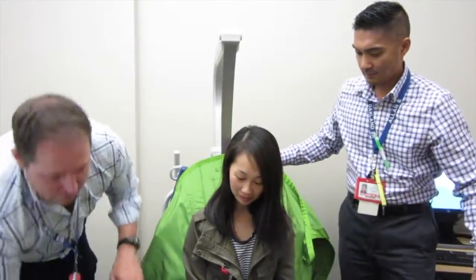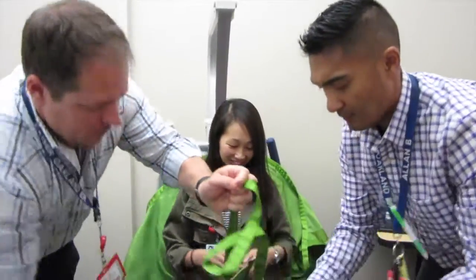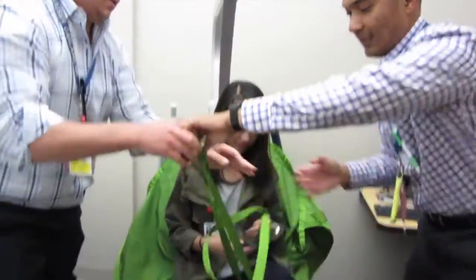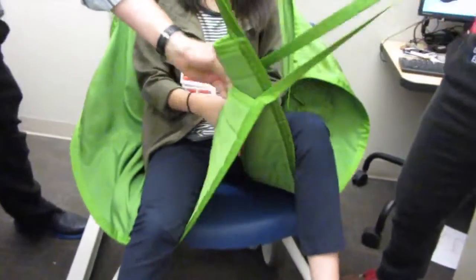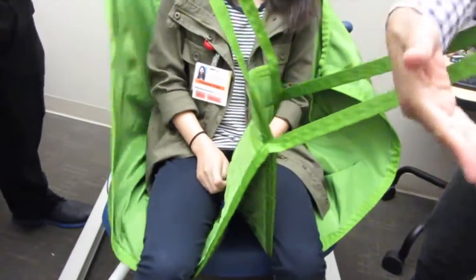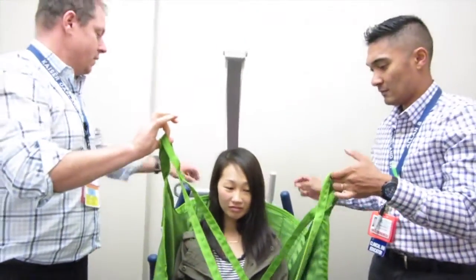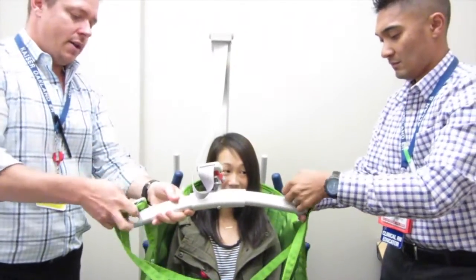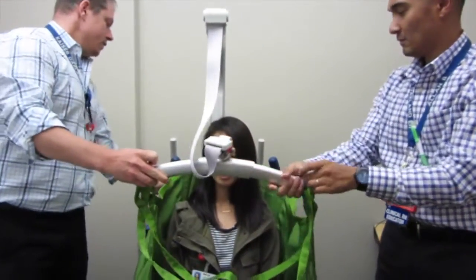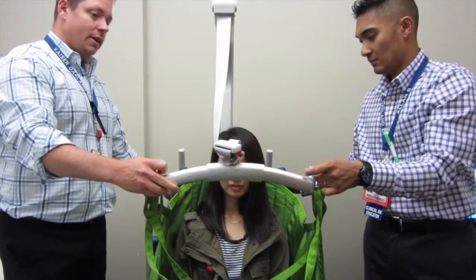And then we're going to have these come underneath her legs, and we're going to cross in the middle. Excellent. That's an important piece. Please make sure it's crossed. If it's not crossed like this and just like that, your patient will slide right through. Okay. So then you bring the sling ends together, bring the bar up and over, careful not to hit the patient in the head. And then once you're ready, wheelchair is locked, you can begin the lift.